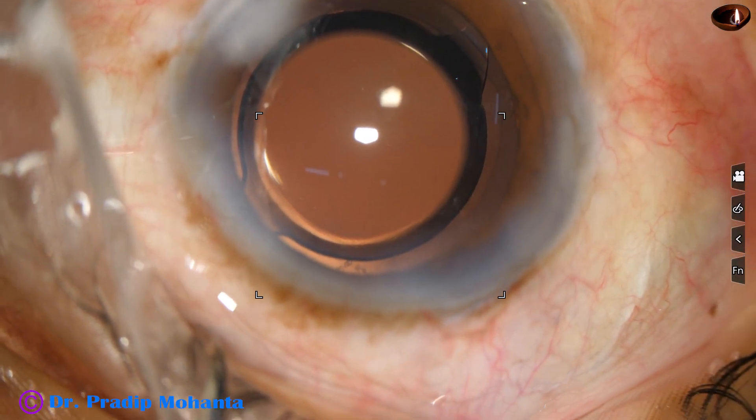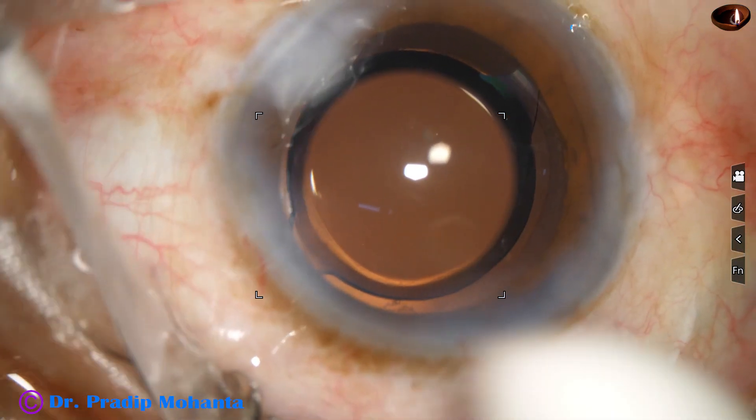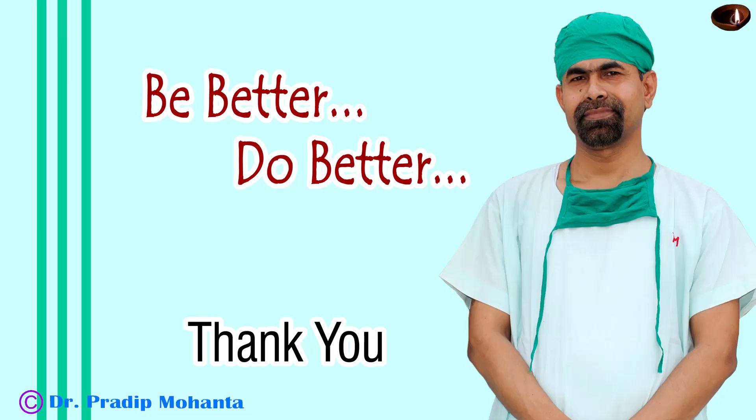Integrity of all the wounds is checked. Few drops of Moxifloxacin are applied over the ocular surface and the case is concluded. Thank you very much for your attention. Hope this video will help you in developing your surgical skills. Be a great surgeon and serve your patients with love, respect, empathy and great surgical competence.